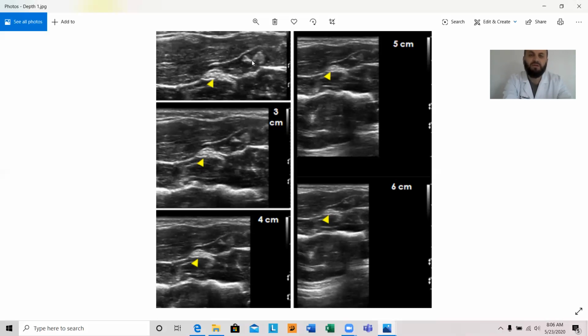I like this image because it's really close. The frame rate is really high. When I freeze the image, I have more options to choose the right image and read it. If I'm a reading doctor, it gives me more information. If I'm an ultrasound technician and I give it to somebody else, that doctor can also read my image and write the report, because it's closer and has more frames, and he can choose, or I can choose for him, the best frames.